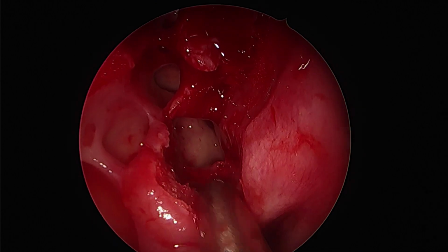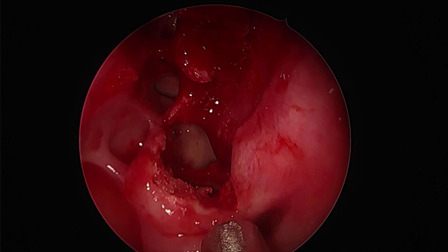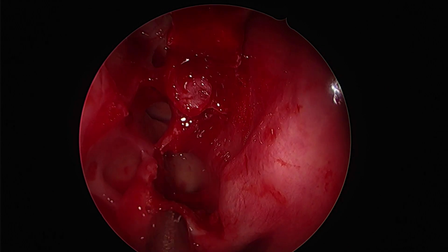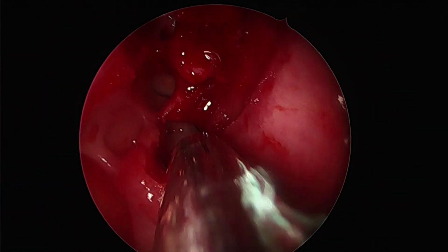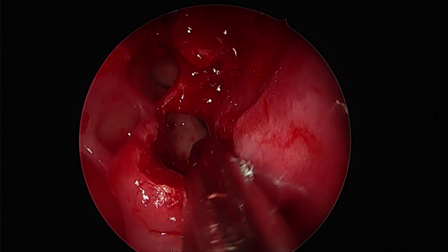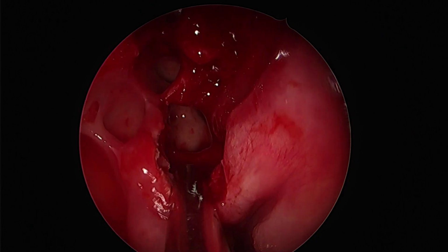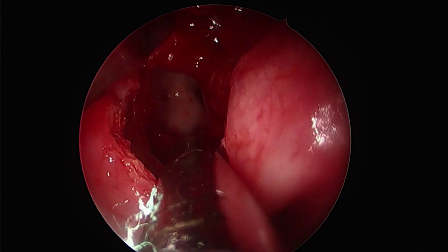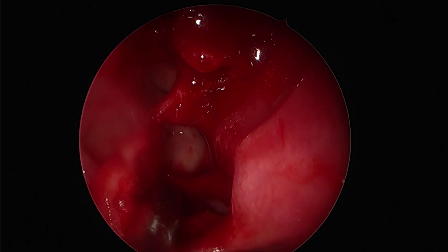One should probably also take notice that we do not want to reinvent the wheel. The part of the prior surgery which has been done well, we do not want to be doing anything there. The mucosa already has healed. There seems to be no justification in trying to do anything more to the mucosa there. The goal of surgery was just to create a straight field for the saline solution for further irrigation, and that has been done partially through a partial middle turbinectomy, and the rest of it is being done now with removing this excessive soft tissue that lies in front of the sphenoid sinus, as well as the Onodi and the bone that separates the Onodi from the ethmoidal cavity.